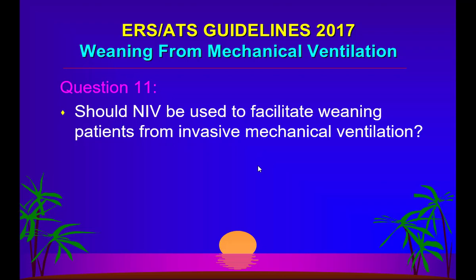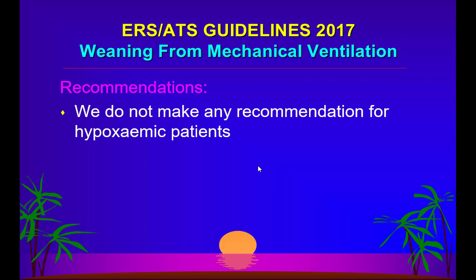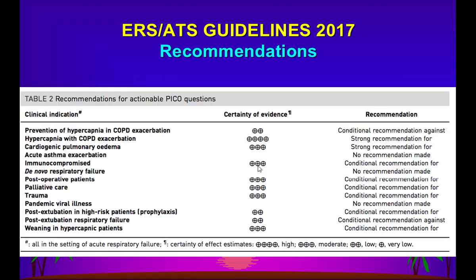Okay. Should NIV be used to facilitate weaning patient from invasive mechanical ventilation? Conditional for, yes. The NIV should be used to facilitate weaning from mechanical ventilation in patient with hypercapnic respiratory failure. Should weaning from mechanical ventilation, we do not make any recommendation for hypoxemic patients. In hypoxic patients, there is no recommendation. You may try if you feel, otherwise it's up to your thinking.